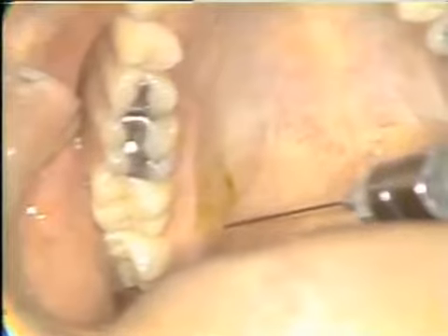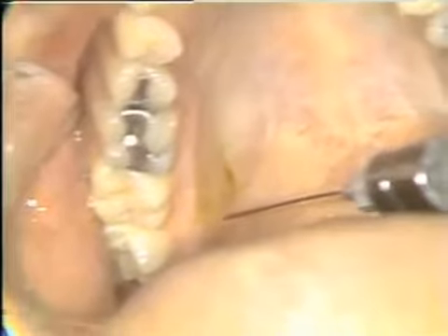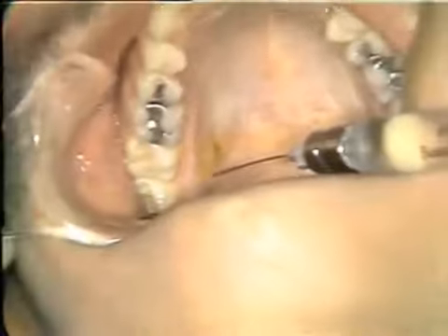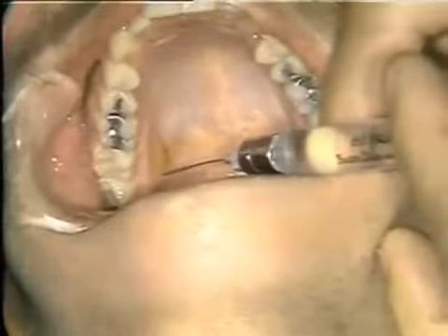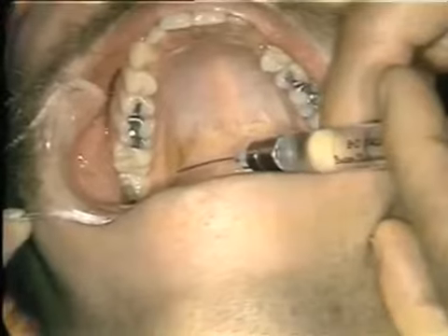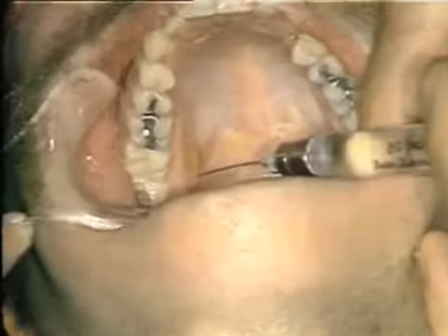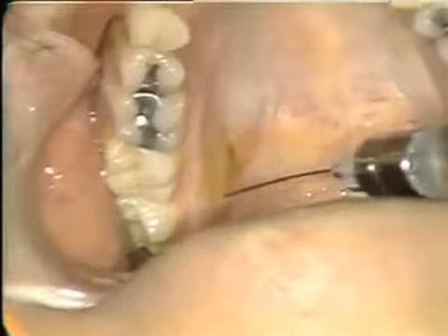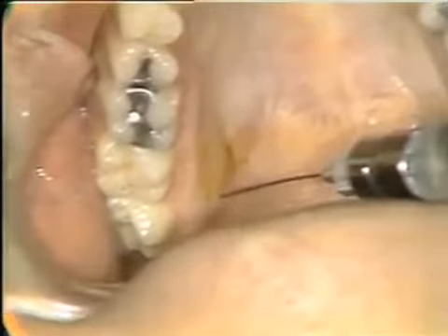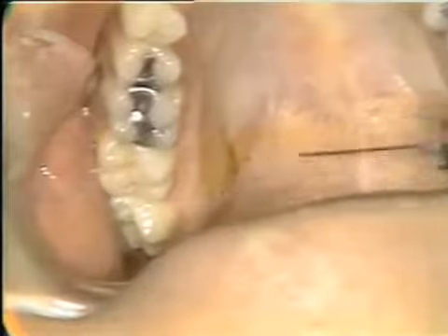And we make our puncture and carry our needle bevel clear to bone. Then we aspirate, again in the usual fashion. And then we expel a few drops, up to a quarter of a cc if you can. And I can see those tissues blanching a little bit. I don't know whether you can see it or not, but we are getting some solution out into the tissues. And we know that we have accomplished our mission, and then out quickly.